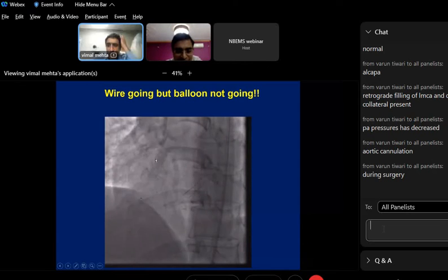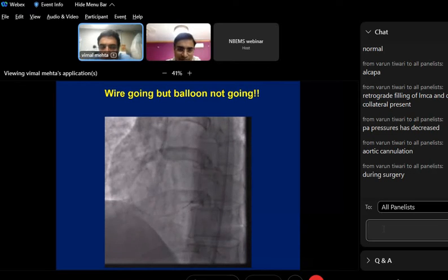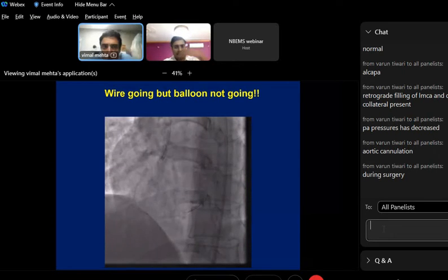Yes, Dr. Sabal, please, sir. You already got a hint. We don't commonly use these catheters. Look at this. These are the catheters, to tell you the hint. Sometimes you have a right coronary artery which is very important. Left is markedly diseased, and the moment you engage it, the catheter is damping, it is ventricularizing. So the patient goes into hypotension. So while you're doing the procedure, you want perfusion to be well maintained through a hole.